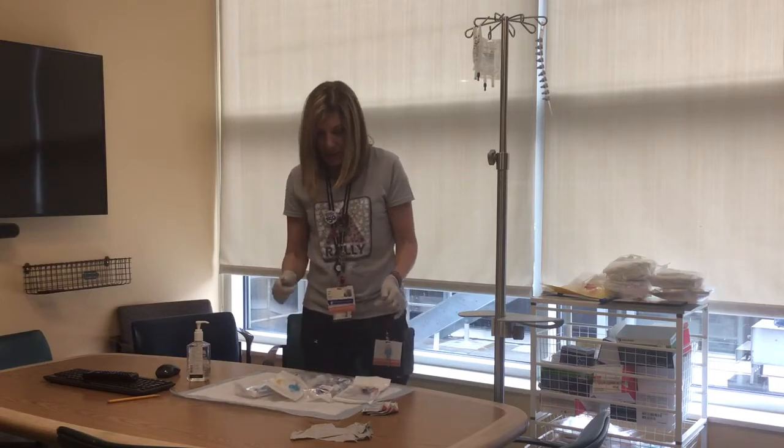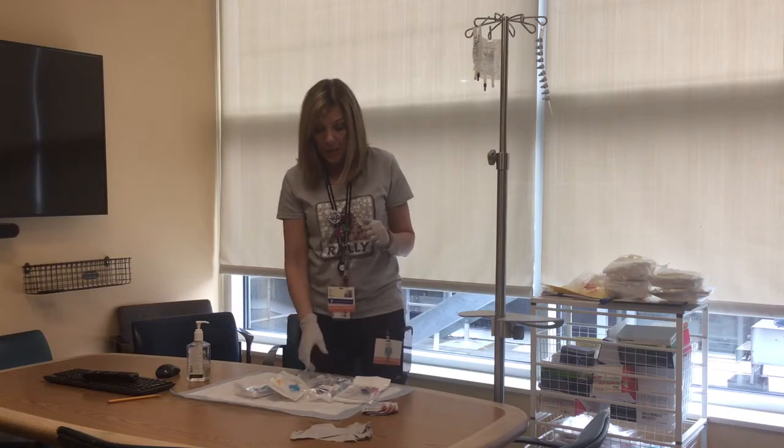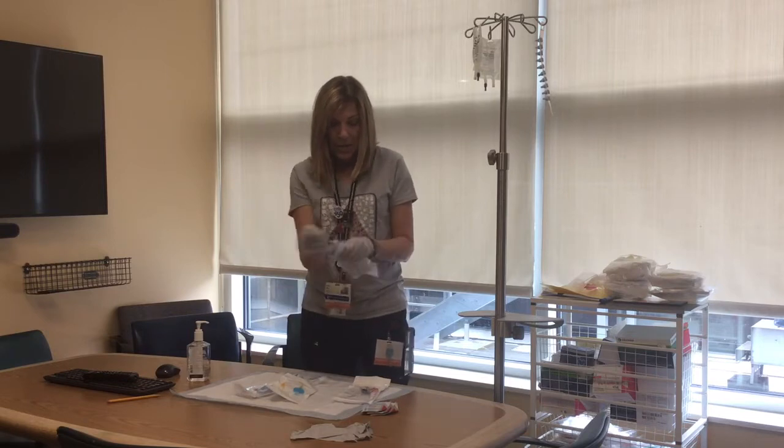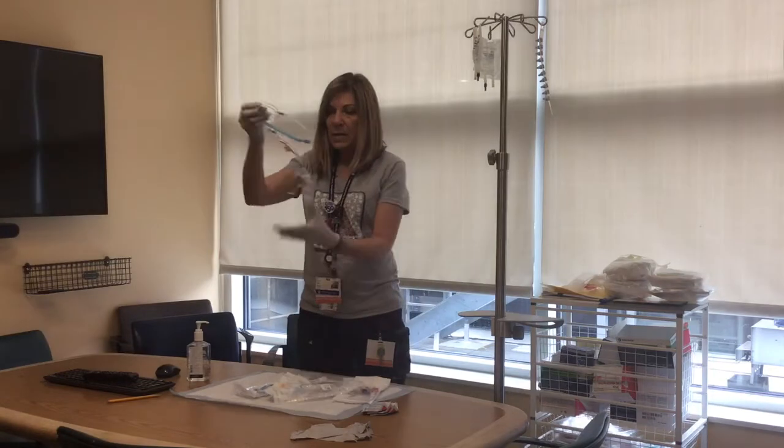The principle behind this is that you are not going to put anything back down. You're going to prime and go from top to bottom. The first thing you're going to do is get your lines primed.